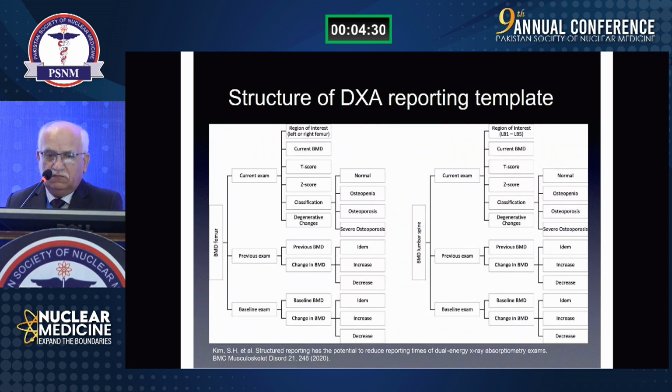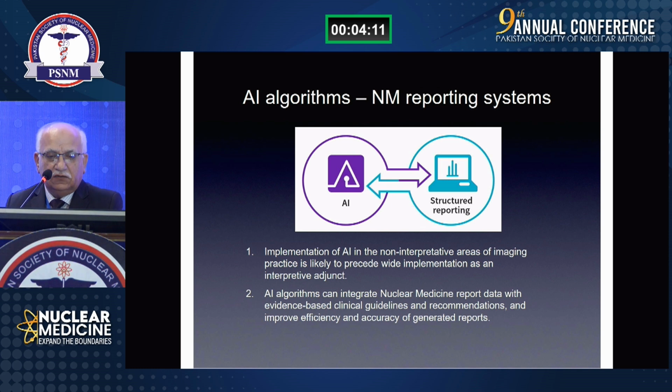Now, this is a format for, say, for example, DEXA reporting, and this is a structured report. You can use this data for further research, and you just have to put a few inputs, and you can dish out a report, which could be a structured report. Now, the structured report is important in the sense of the future.